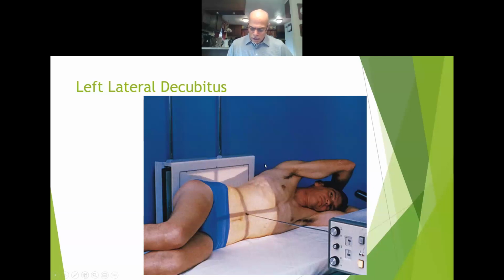Let's see. It says a radiolucent pad is particularly important to ensure the inclusion of the entire dependent side when fluid demonstration is a primary concern. I just said that again. You want this side to be raised. The mattress itself works because we have a little bit of light right there, so that little bit of the mattress is actually going to be exposed and we'll be able to see it.